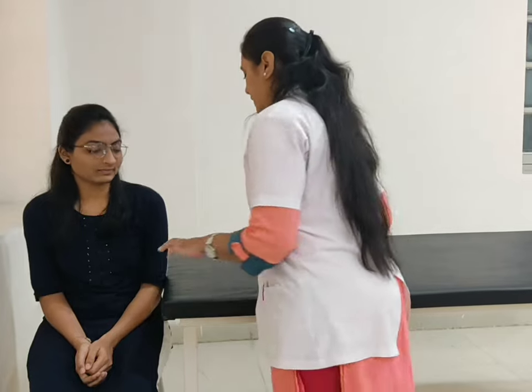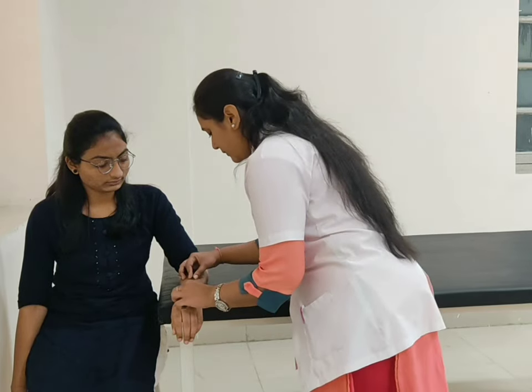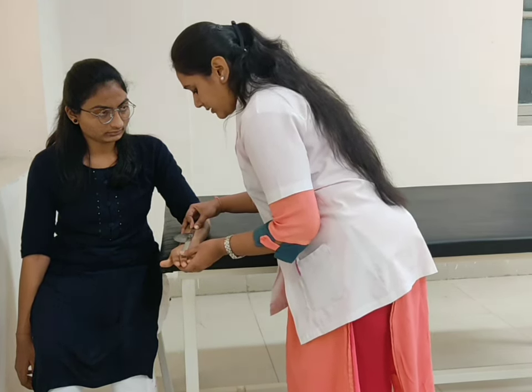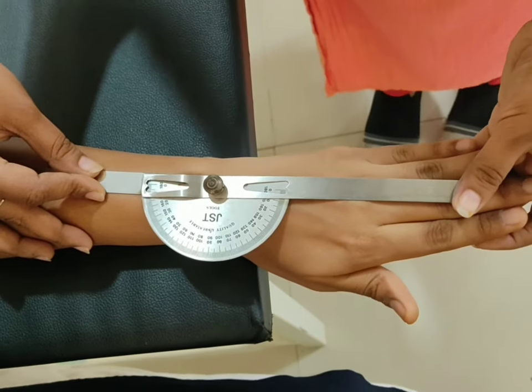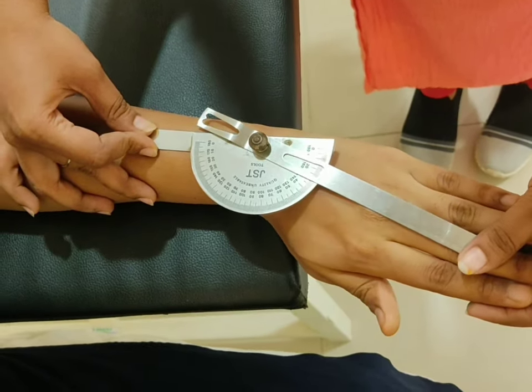For radial deviation, patient position sitting on a table. Forearm pronated and supported over the table. Fulcrum at the mid part of the wrist joint. Stable arm in the midline of the posterior aspect of the forearm and movable arm in line with the middle finger. Now ask the patient to move your hand towards the thumb. Normal range of radial deviation is 20 degrees.